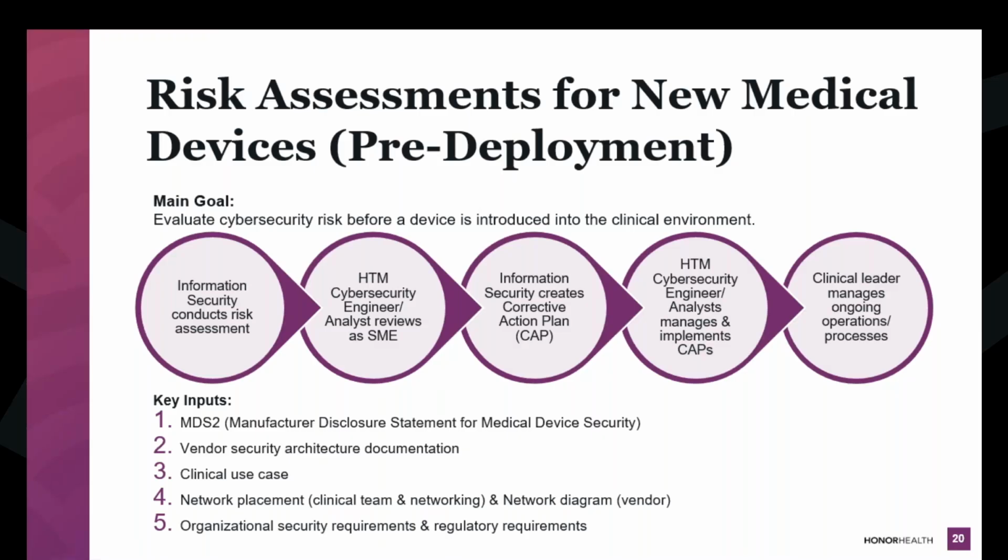They might call it a white paper, an architecture document, but they have some kind of security document because everyone's asking for it. You also need to know what that clinical use is of that piece of equipment, right? Is it just a standalone unit that maybe it doesn't even need to be connected to the network, or does it need to be connected, and to what? So how is it going to be used in the clinical setting? Is it going to move from room to room? Or is it going to stay in one room? Do you have a multi-million-dollar robot that they decide we're going to wheel it around between operating rooms, right? Is it advisable? No, but does it happen? Yes. So what does that clinical use look like?